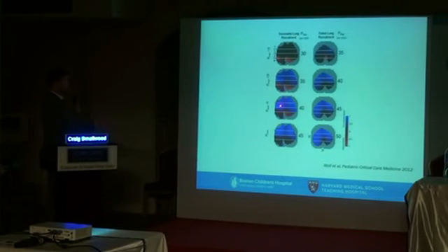And then as we step up the pressure, you can see that we first have to overdistend a lot, and then once we overdistend enough and apply enough of a peak inspiratory and expiratory pressure, we see a resolution of that dorsal collapse, and then we can titrate the PEEP down and maintain alveolar recruitment. And over here, all we did was overdistend. We didn't reduce any atelectasis because they didn't have a lot.